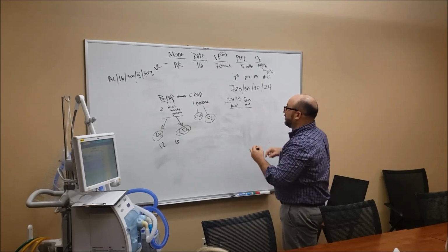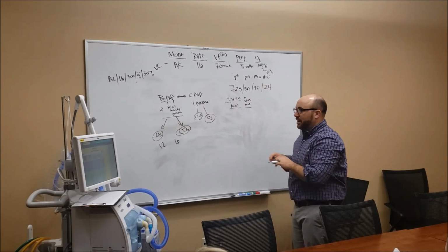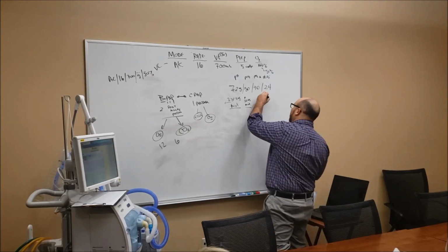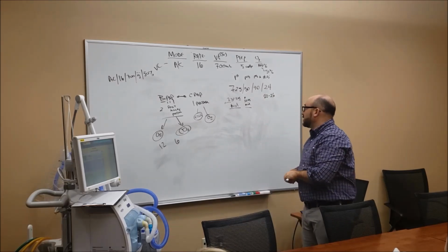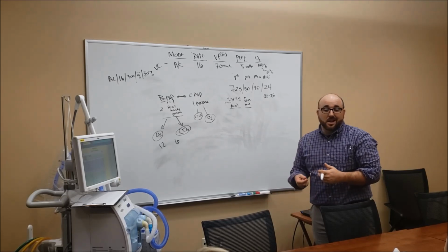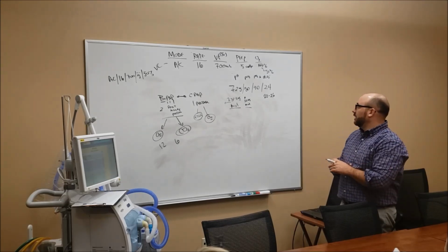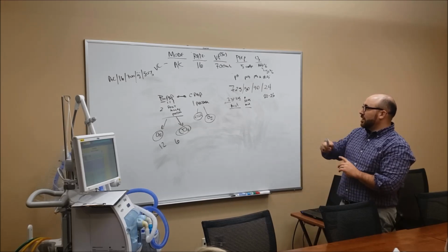So this is a respiratory acidosis. PO2 is within normal limits as far as if they're on room air. That's key, because PO2 changes a lot on non-room air. And what's normal for your bicarb? 22 to 26. Good job. I put it right in the middle, so that's normal. This is an uncompensated respiratory acidosis. If you're in school, you have to know that right off the bat, but in the clinical case, we just need to know they're acidotic and it's coming from the respiratory system.